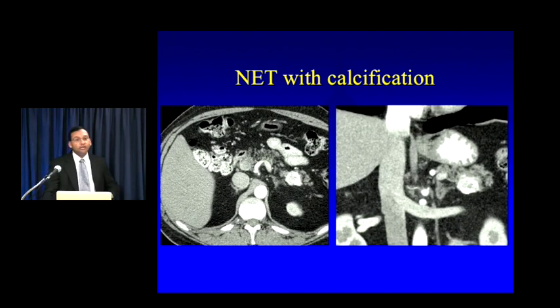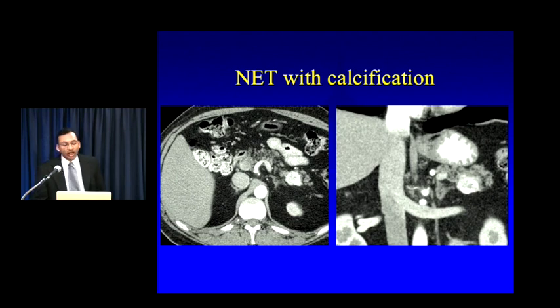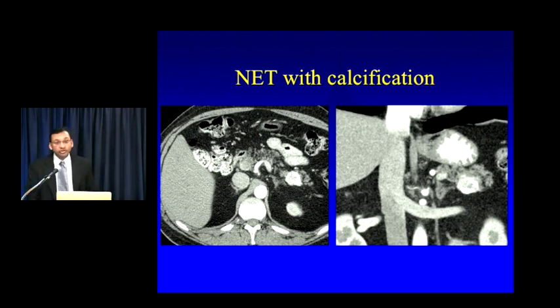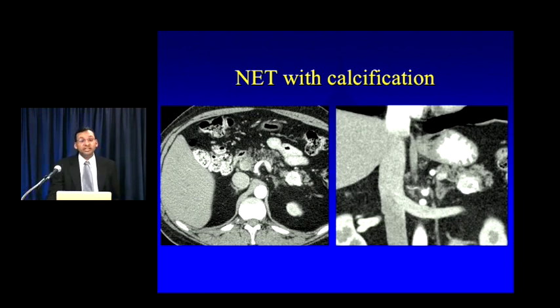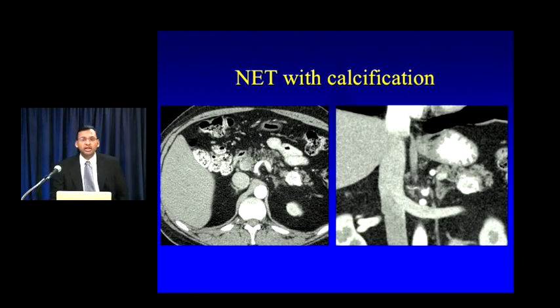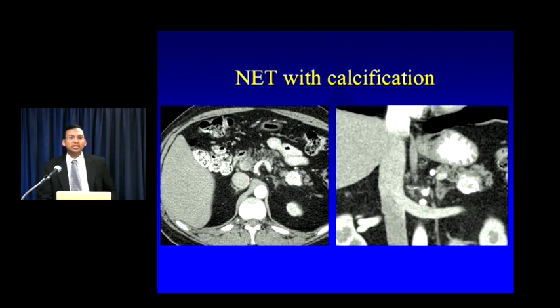If you see a calcified pancreatic mass, you are not dealing with an adenocarcinoma — period. This virtually never happens in the absence of treatment. On the other hand, calcification is quite common with neuroendocrine tumors. These calcifications can be very diffuse, as in this case, or stippled and involving just part of the lesion. Any time you see a calcified solid pancreatic mass, you have to think about a neuroendocrine tumor.